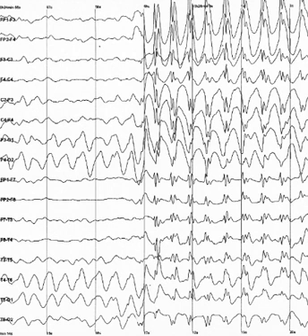Later study revealed they were generated by rapid fluttering of the eyelids, sometimes so minute that it was difficult to see. They are in fact noise in the EEG reading, and should not technically be called a rhythm or wave. Therefore, current usage in electroencephalography refers to the phenomenon as an eyelid fluttering artifact, rather than a kappa rhythm or wave. Some of these artifacts can be useful in various applications.